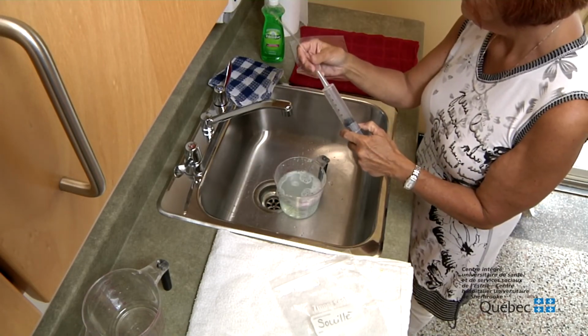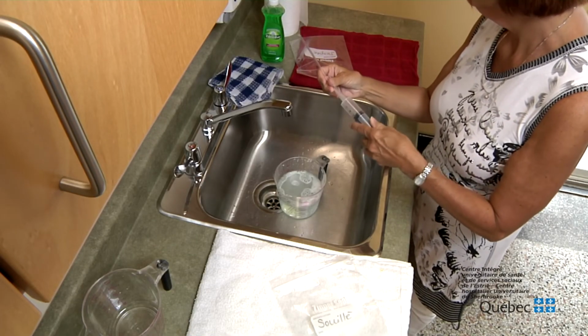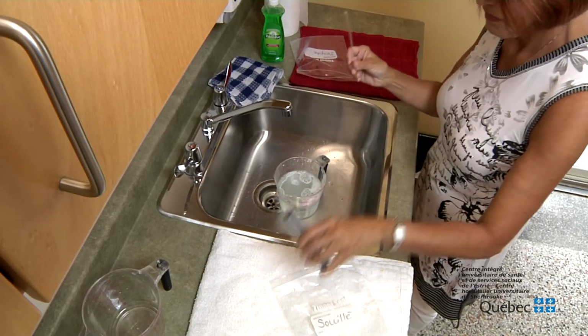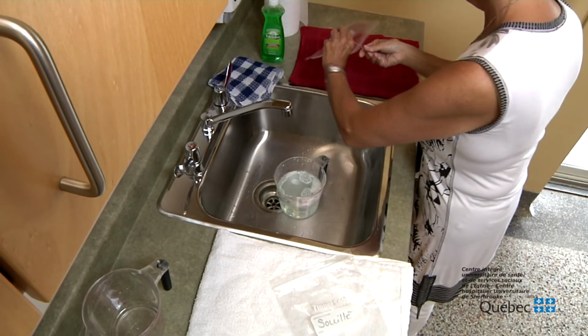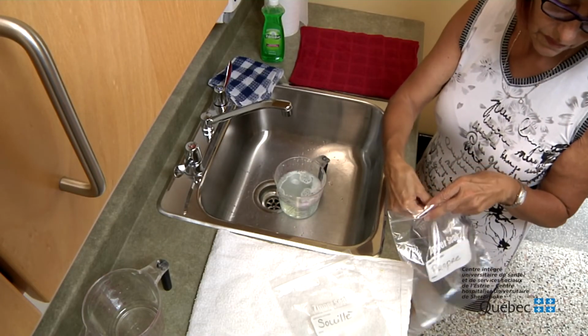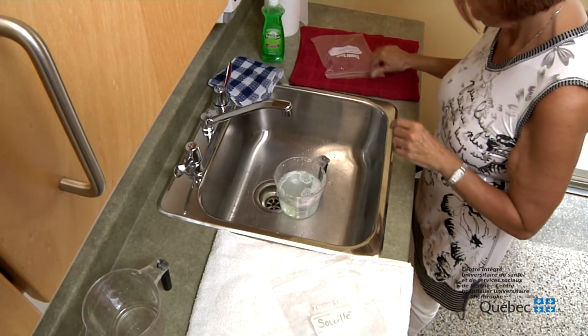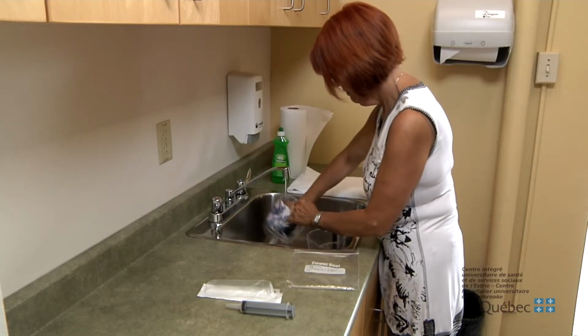Use the syringe with a catheter tip to push air through the catheter to dry the inside. Then, place the catheter in the plastic bag marked clean. Repeat the process with all the catheters. Wash the measuring cups with hot soapy water.